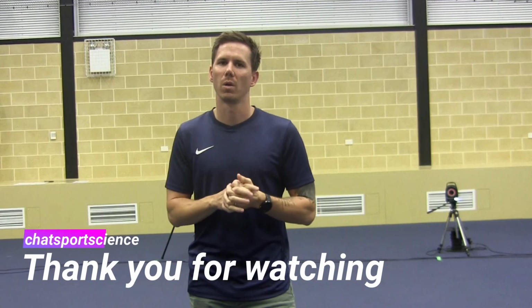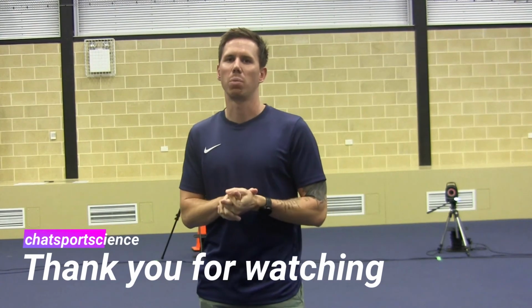So that was part 1 of the Vicon camera setup. Part 2 will involve the marker placement as well as subject calibration, and then we'll move on to part 3, which will be a live trial.